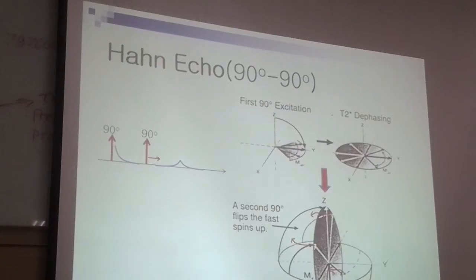So first, I would like to explain about the Hahn echo. In the previous lecture, I already explained about gradient echo and spin echo.